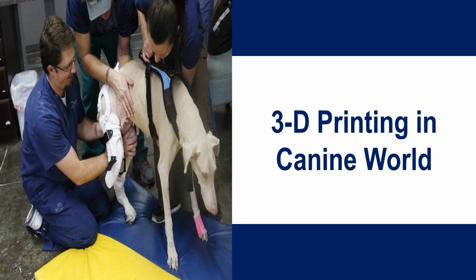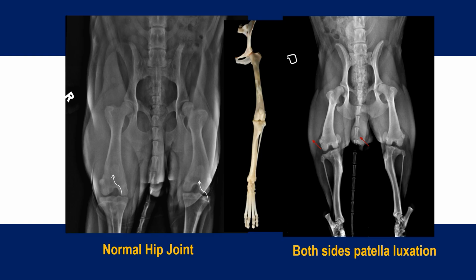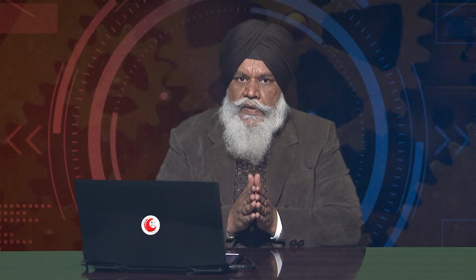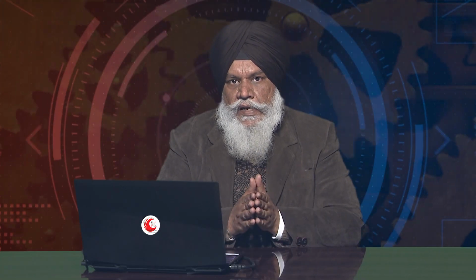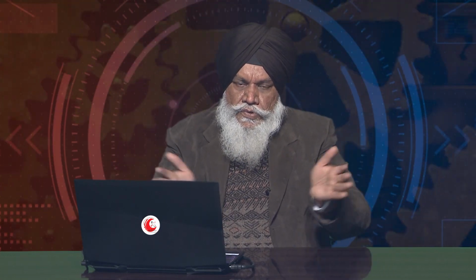Similarly, in case of the canine, people have reported the development of different prostheses. In one of the works, we have developed this stifle prosthesis in our lab, and we hold the patent for this. What is the problem for these types of dogs? Because of the damage of the patella bone, basically, there will be either a medial patella luxation or a lateral patella luxation, meaning the legs are going either on the outer side or they are skewed to the inside.